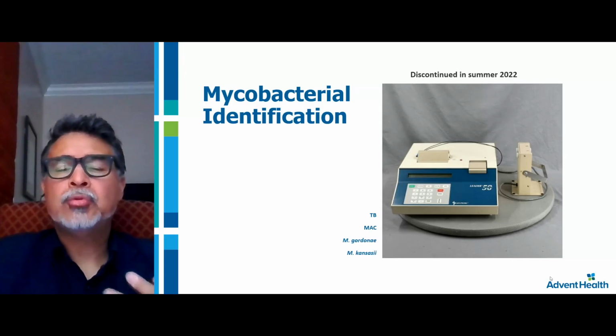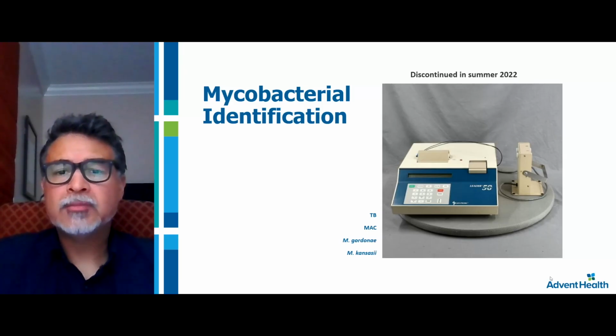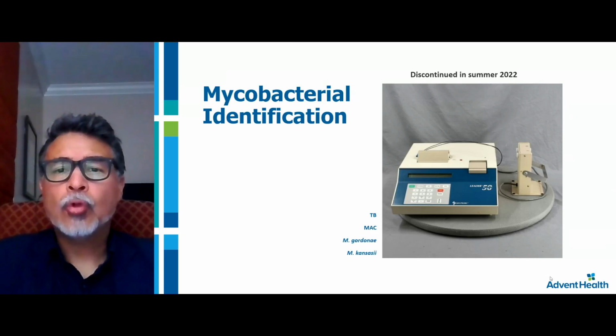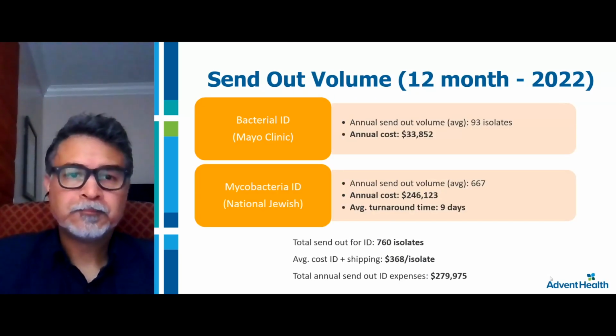Now, we were able to develop an application for whole genome sequencing, since we were evaluating multiplex PCR or whole genome sequencing, which also allows us to expand beyond mycobacteria to bacteria and also to molds.